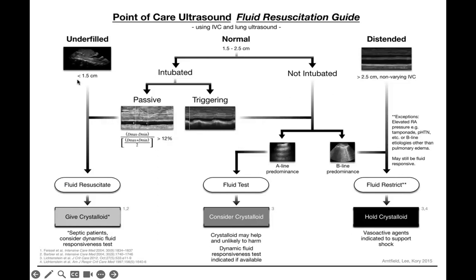And then this is good literature in both intubated and non-intubated patients. And you can pretty confidently fluid resuscitate your patients and know that you will be improving or likely improving their cardiac output with fluid resuscitation.